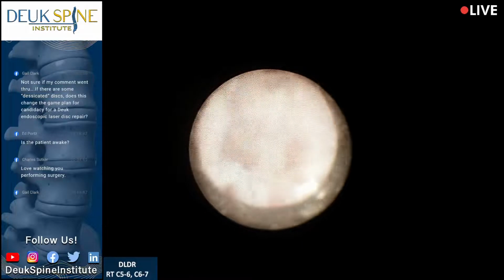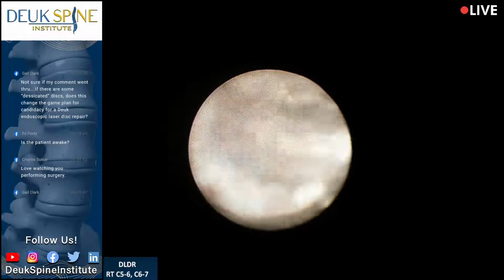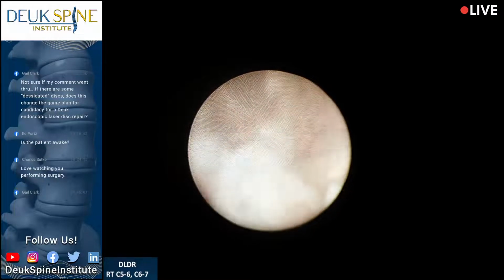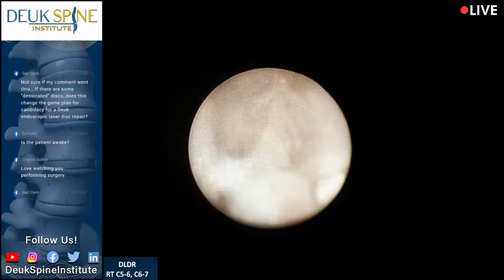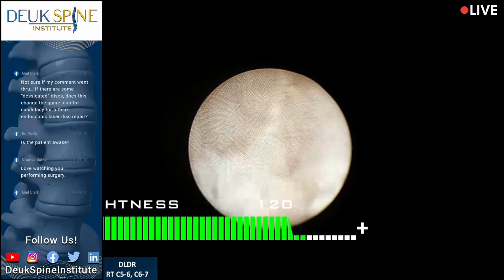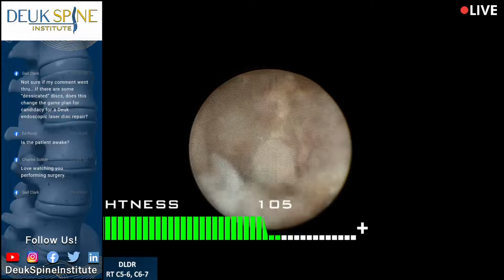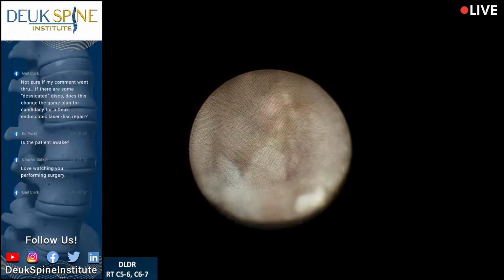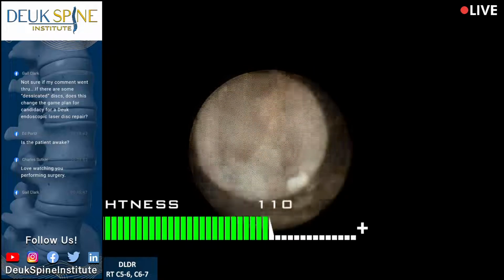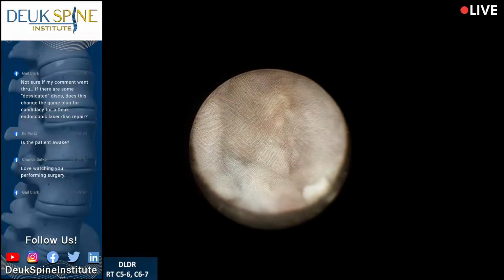Oh, a new scope. Can you go down, on the right side? There you go, up, down, go down. Too much. More. Keep going. That's good. Perfect. Thank you. It's a little too dark. Go back one. Thank you very much. That's good. That should be all right.